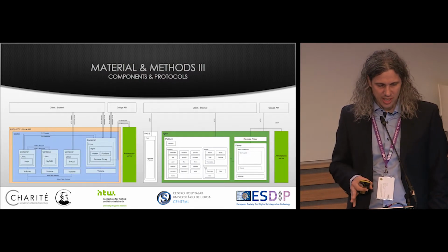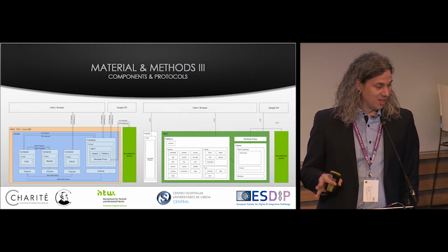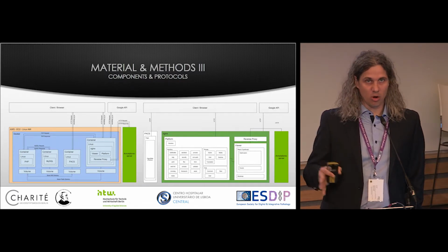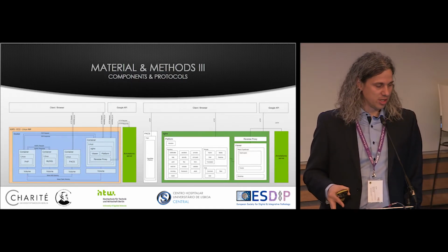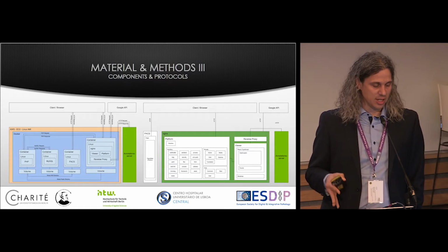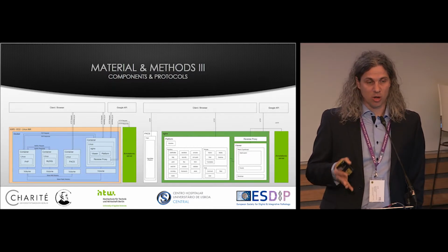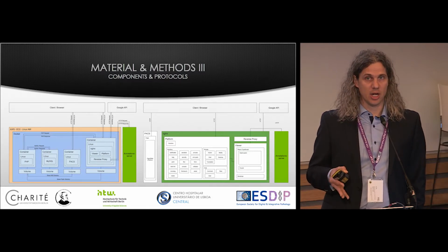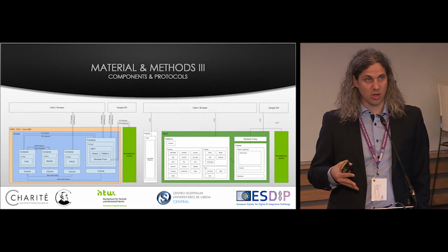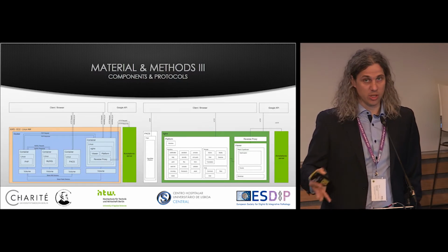Just to show you some details, I don't want to go too far, and that's probably one of the slides I'm going to skip a little. I'll show you something about the infrastructure. It's a highly distributed infrastructure. All subsystems are in dedicated Docker containers, so we can easily deploy them onto different systems. The idea behind this was especially that we wanted users to be able to host their PACS systems with their whole slide images locally, and not upload all images to a centralized platform. So it is possible to have a distributed PACS system within that platform, and you can host your whole slide images, for example, in your institution.